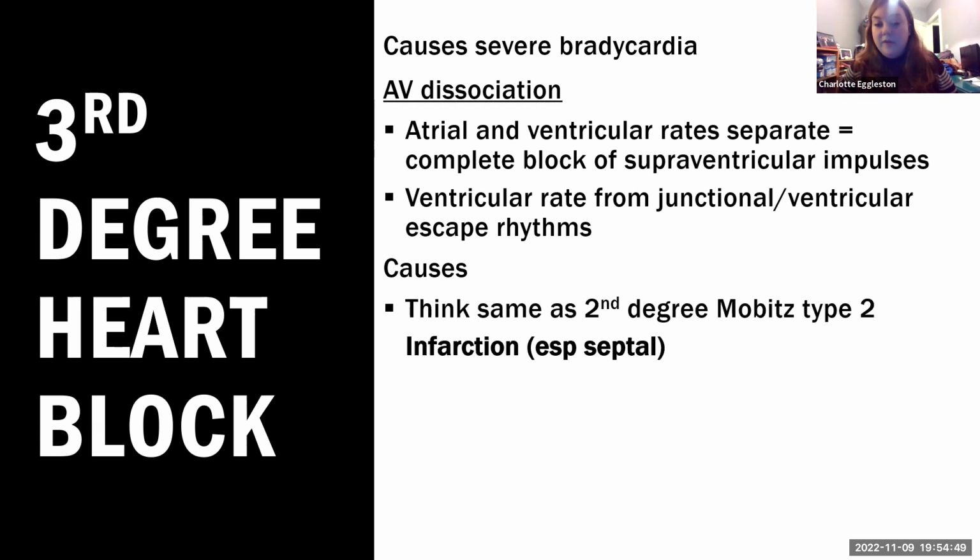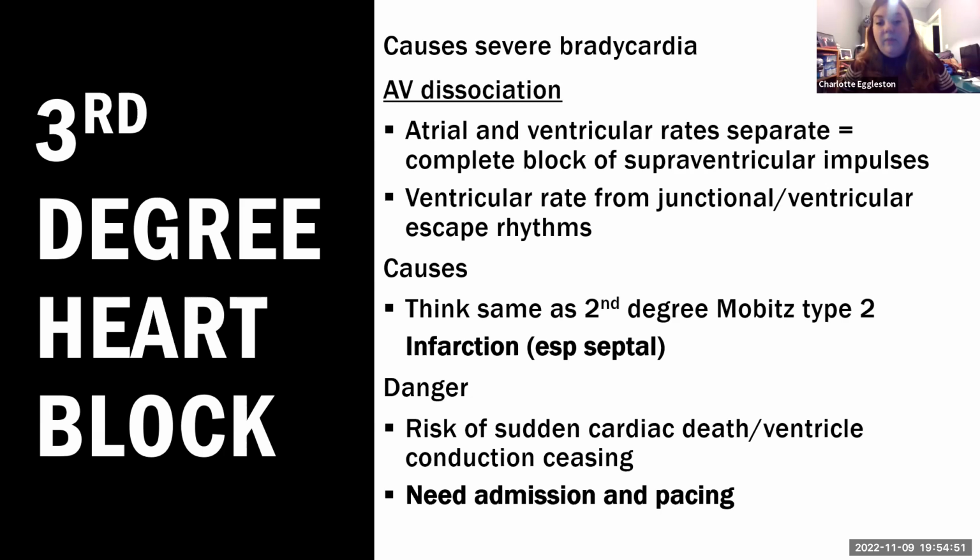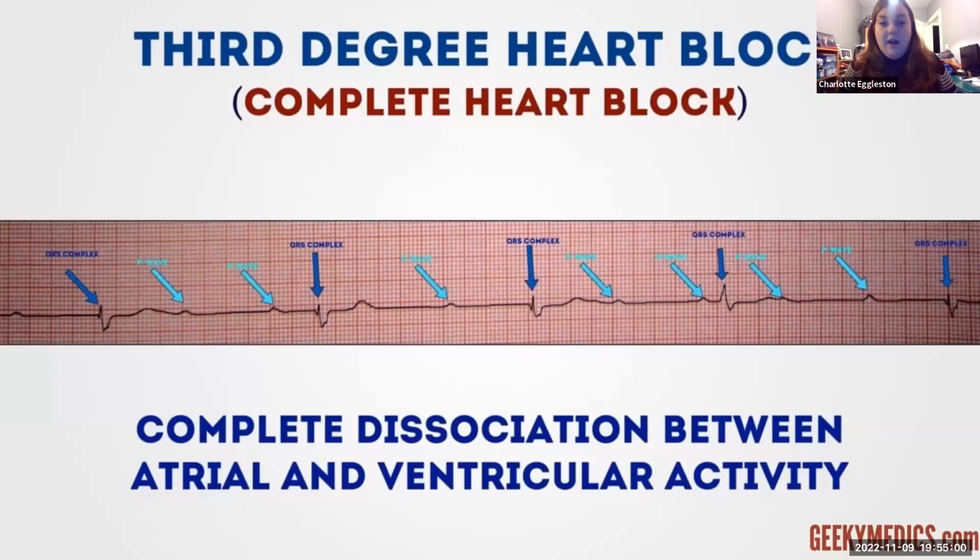This one tends to be the same causes as Mobitz type 2, and again we worry about this one, that your heart will suddenly stop, or you'll suddenly go into an odd rhythm from somewhere else in the ventricles, and you need to be admitted and paced.